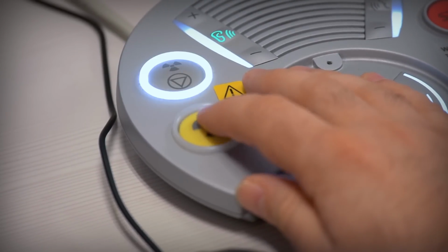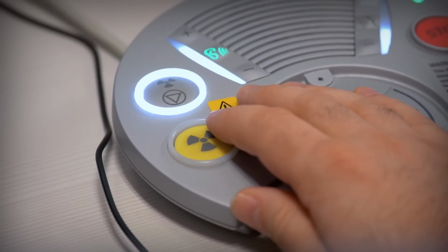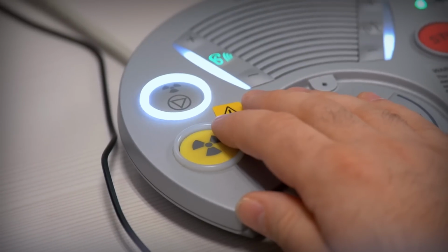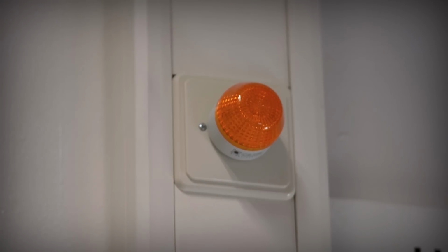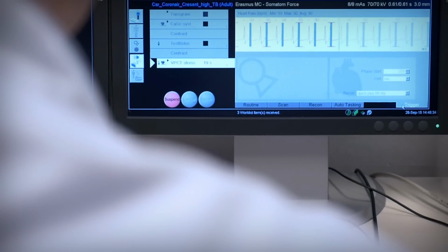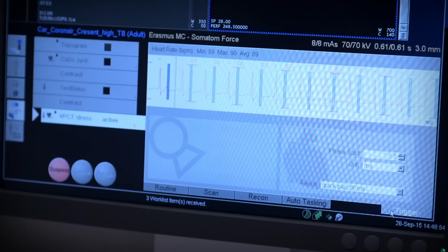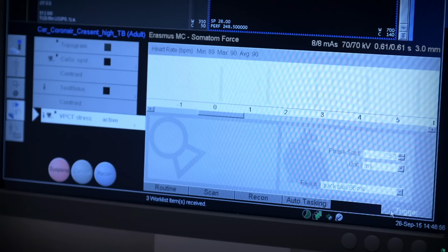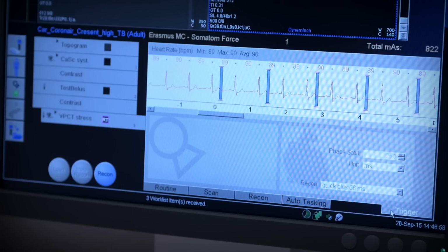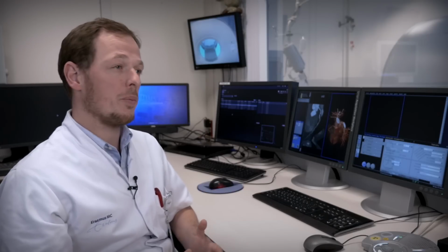The images are acquired during systole. During systole, the myocardium is thicker and more compact, which makes perfusion images better to interpret. In addition, because the cavity is smaller, there will be less contrast and also less beam hardening artifacts on the images. Finally, during a very long scan, the heart rate may change, and in that case, the end systolic images are more consistent over time. After reconstruction, the images are now ready for post-processing.